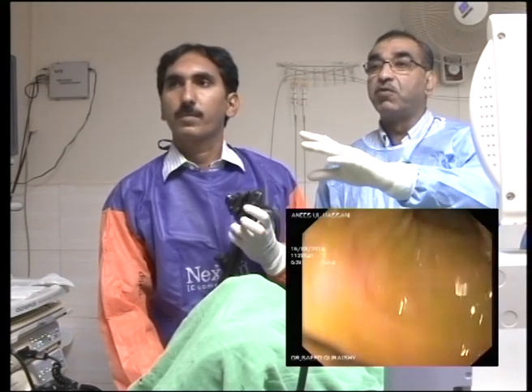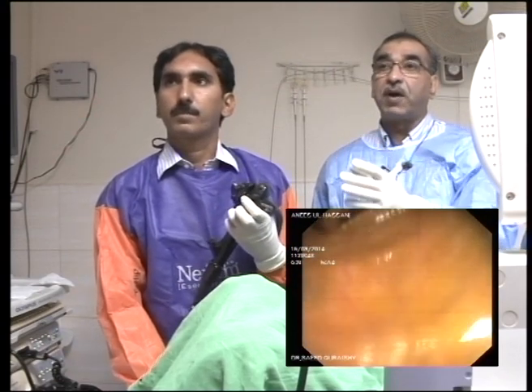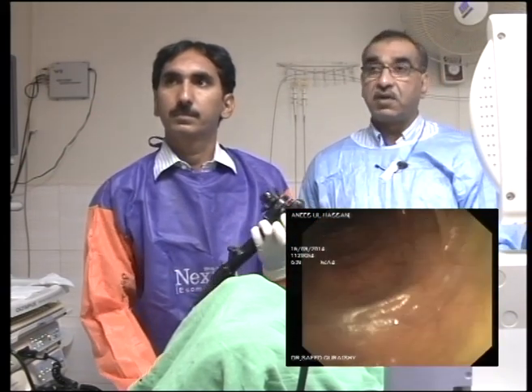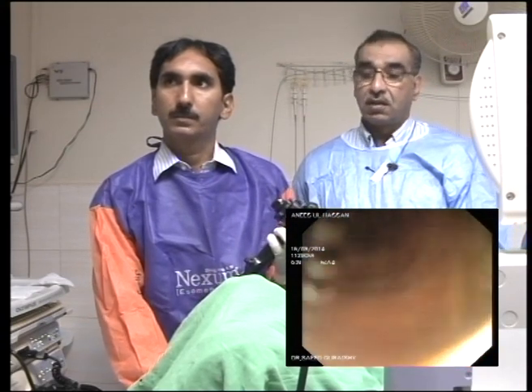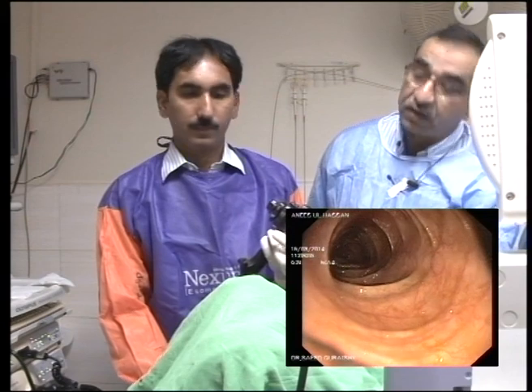It should be a deliberate movement. You are quite all right there. Okay. Just advance. Now point up. Point the tip up. Up. Up. Up. Keep going. And now just advance. Keep advancing. Don't inflate. You don't need to inflate. Take your finger off the inflation button.